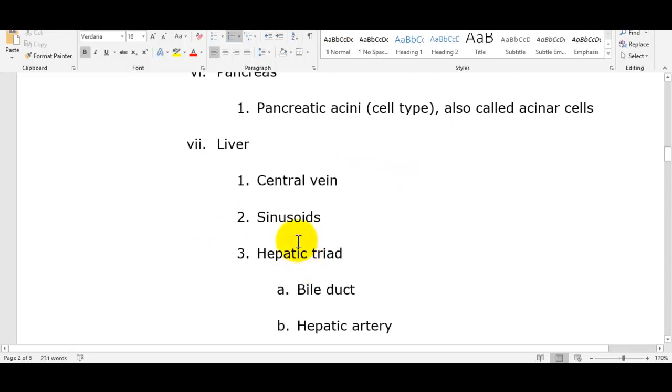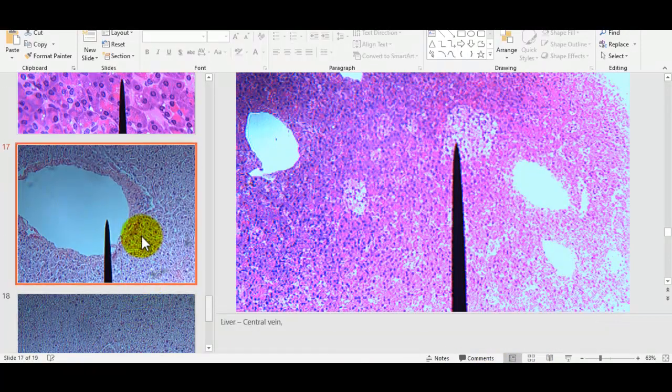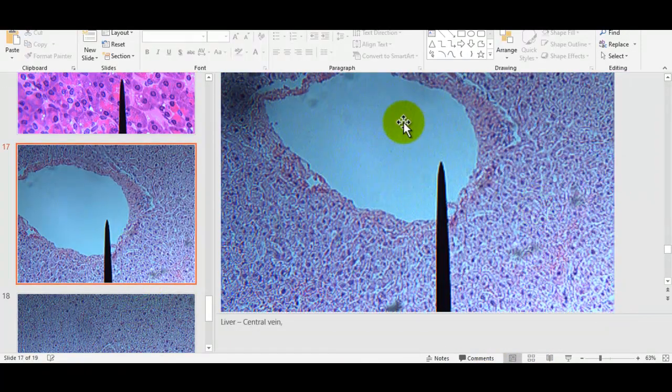Last slide, the liver. The liver is separated into lobes. Did that with the other video. Right lobe, left lobe, caudate lobe, quadrate lobe. But even within those bigger lobes, they have smaller sections. And they're all connected to what's called a central vein. All the little small sections. A central vein on a slide looks like that.